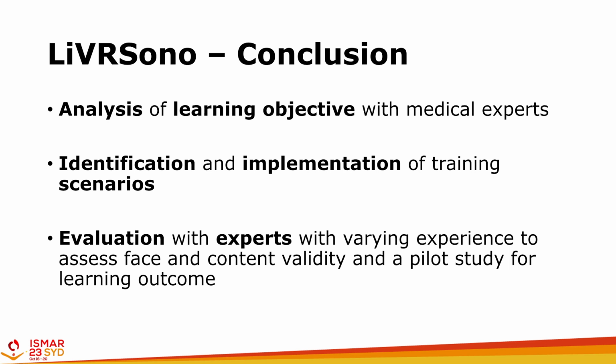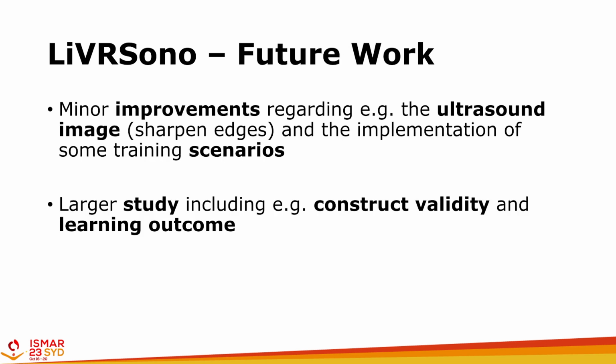In the future, we first want to improve, for example, the ultrasound image by sharpening the edges and change the implementation of some training scenarios. And after these minor changes, we want to conduct a larger study to assess, for example, the construct validity, the learning outcome, as well as the learning transfer.